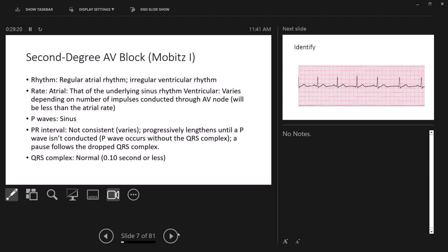They're never getting down to the ventricles. So the ventricles have to kick in and do their thing. And because they contract at a lower rate, you're going to have more Ps than you are going to have QRSs. But the PR intervals literally kind of look like an accordion. It's all over the place. All right? Just remember that.